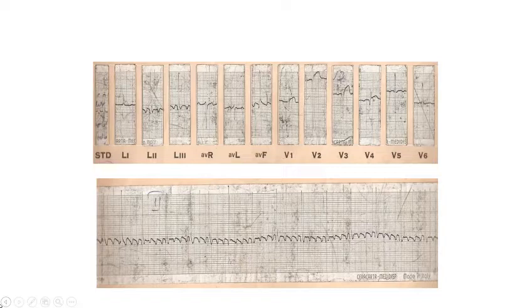In such cases, sir, if we have irregular rhythms like this, and sometimes coarse fibrillation also, we get confused, sir. Sometimes differentiating is difficult: whether it is flutter, coarse fibrillation, or flutter with varying conduction. On the electrocardiogram there is no difficulty because you can see the flutter waves, which can be easily recognized. Sometimes when the atrial flutter is with varying AV conduction, it is impossible to differentiate it from atrial fibrillation. For an irregular rhythm, one of the differential diagnoses of atrial fibrillation is atrial flutter with varying block. So sometimes there can be a difficulty.